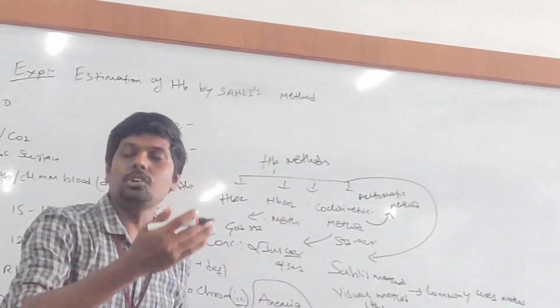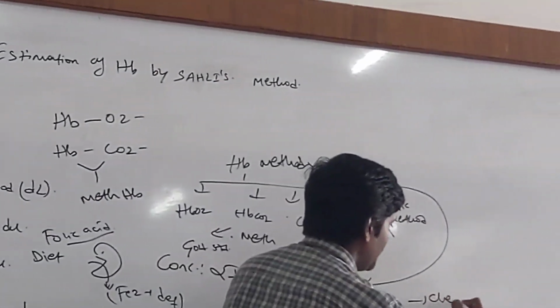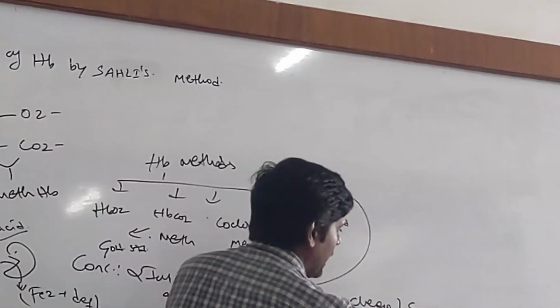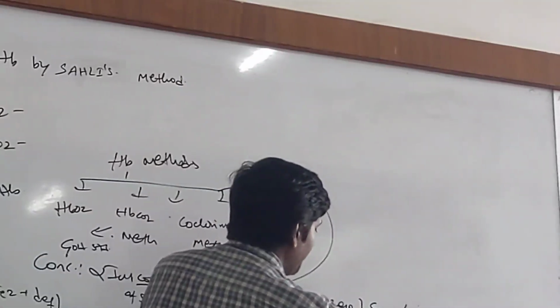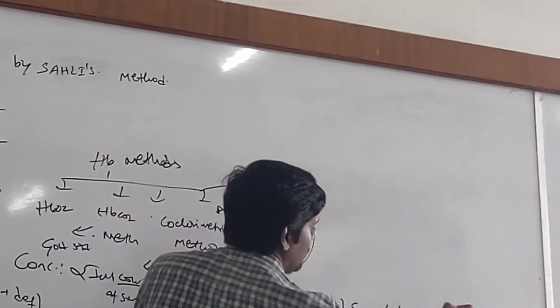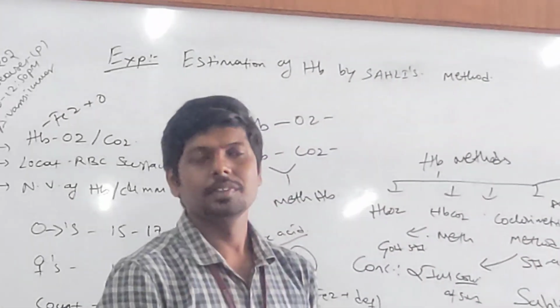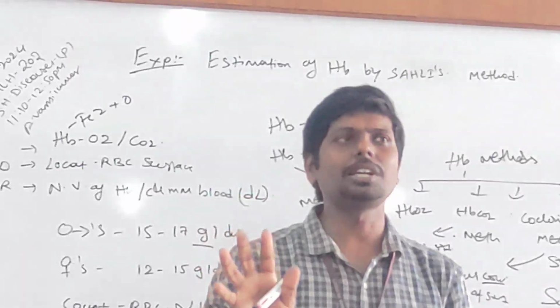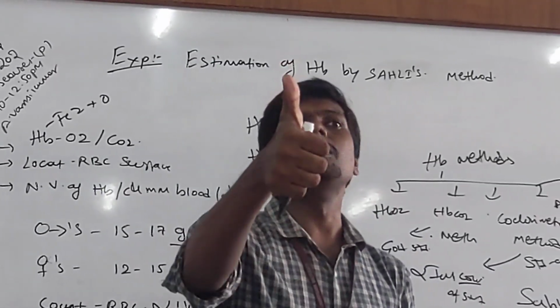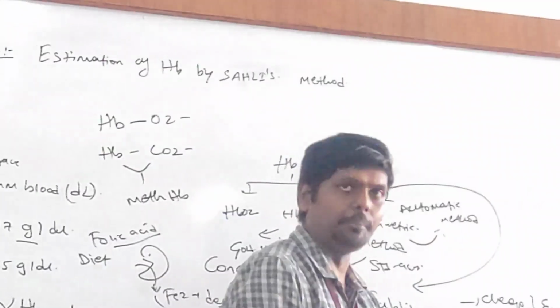Can you guess why it is commonly used? Because this is cheap, easy to perform, and needs less manpower to do this test. It is cheap and economic. That is always our first priority in healthcare. Affordability. First we should go with the cheap tests or simple tests.